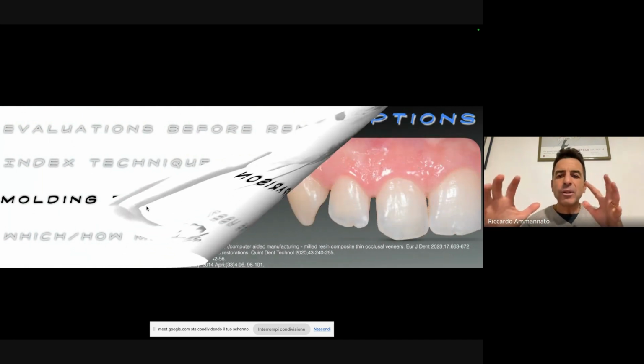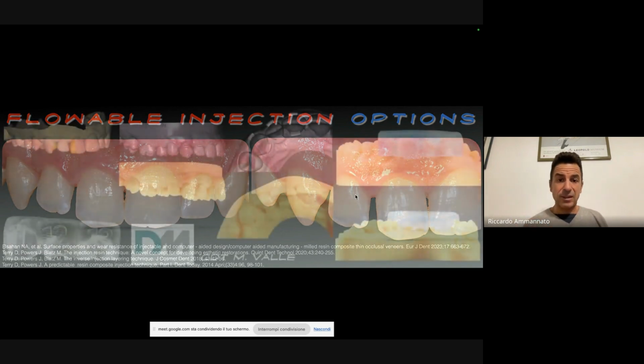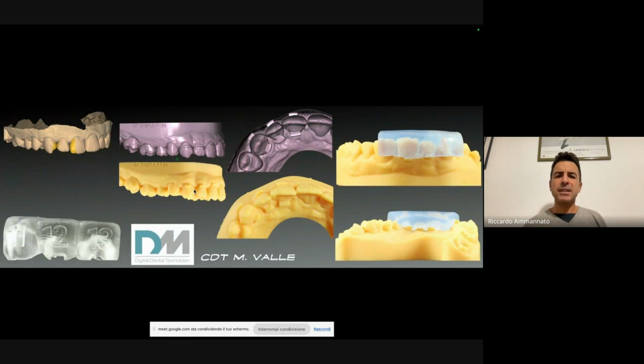So I just want to share with you, because I also do some cases with flow injection, like in this case, to close the diastemas. This case is outside of the full dentition situation, okay? But it's just to share with you the differences between a flow injection and my single index technique that I've just shown you here. So this case, I need to close these diastemas. This was the desire of that very, very young patient, 20 years old.